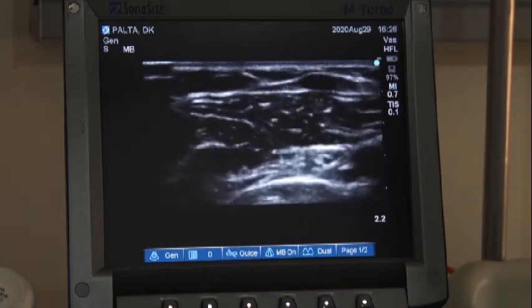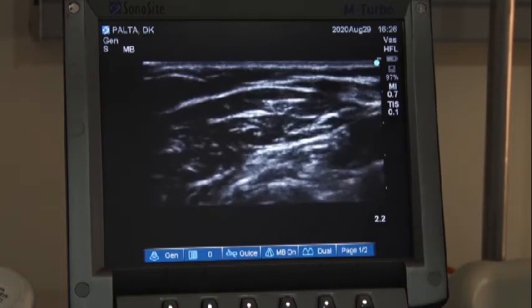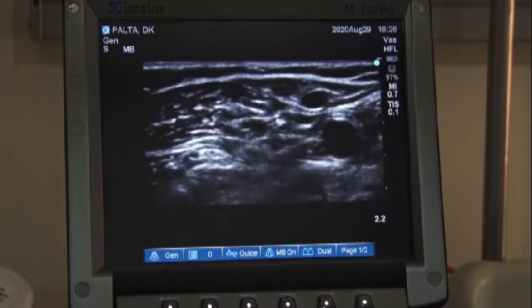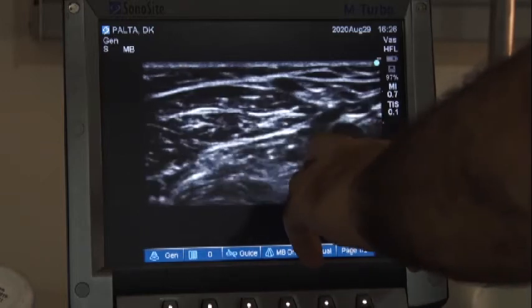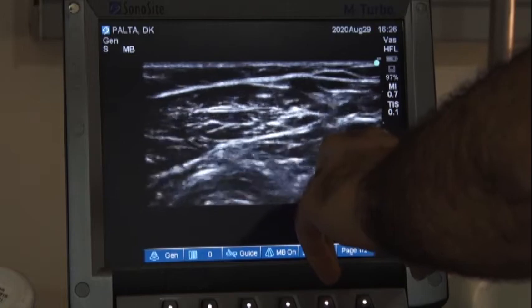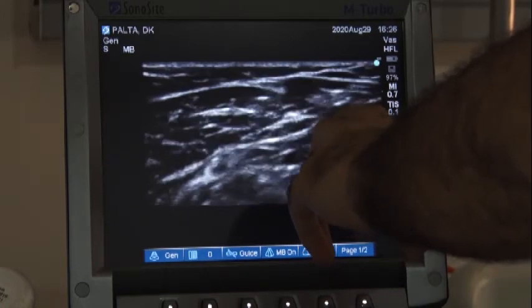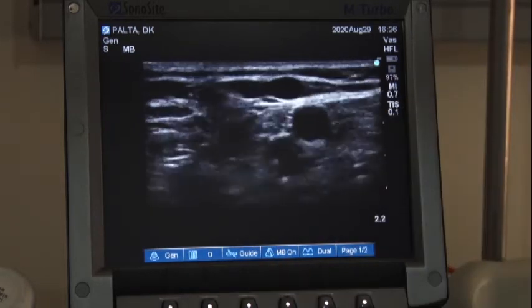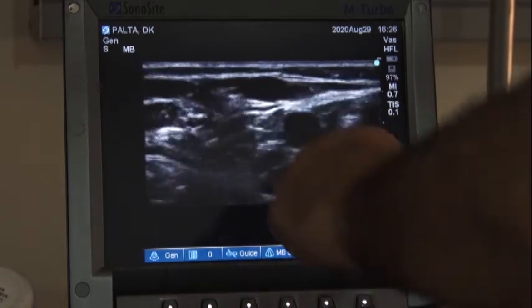This is the main vein near the elbow. Near the elbow it's joined by a deep vein. This is a deep vein, this is the brachial artery, and this is a deep vein, the vena comitans. It's one vein, the median cubital vein, coming and joining the cephalic vein of the forearm, and then again dividing.